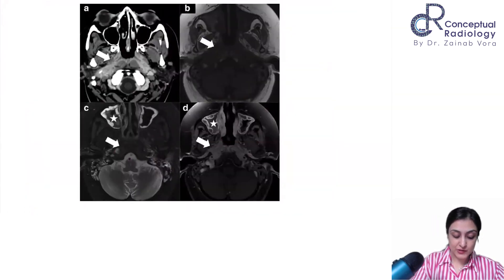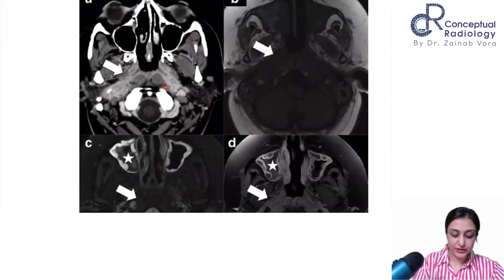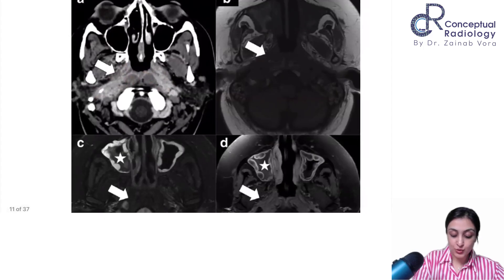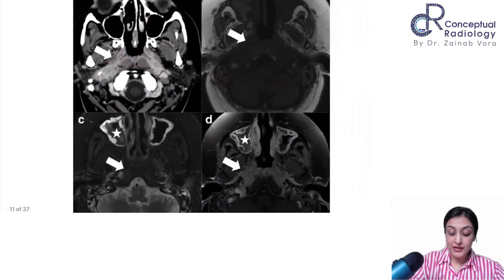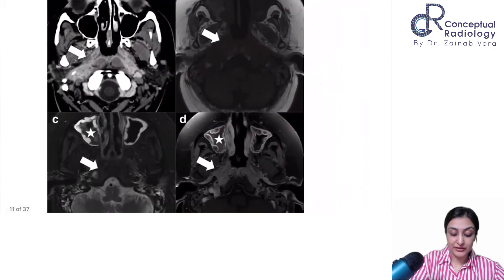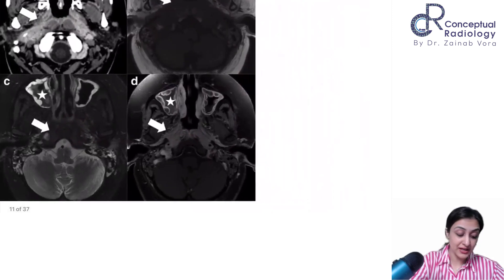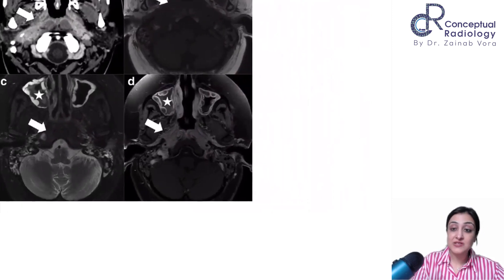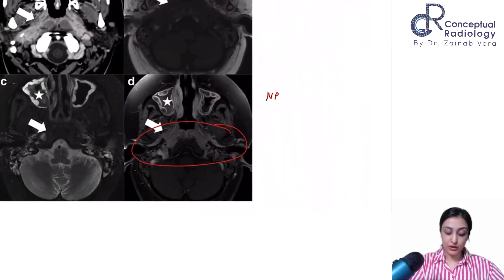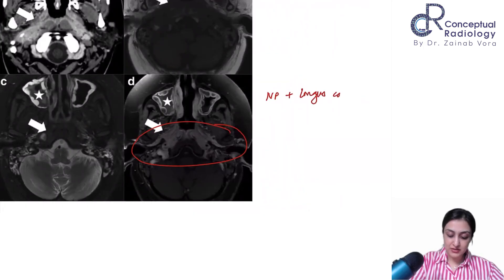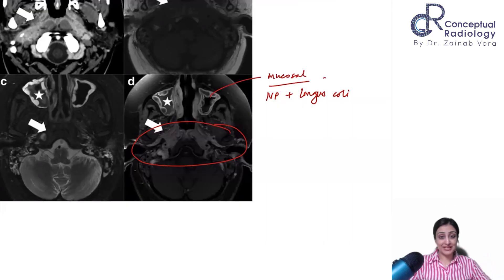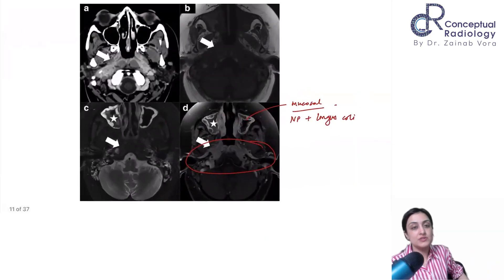A nice case showing diffuse infiltrative nasopharyngeal involvement, with the longus colli muscles also infiltrated. This is skull base or nasopharyngeal involvement — very T2 hypointense infiltrative tissue showing enhancement on CT. Paranasal sinus involvement is also seen with associated mucosal thickening.